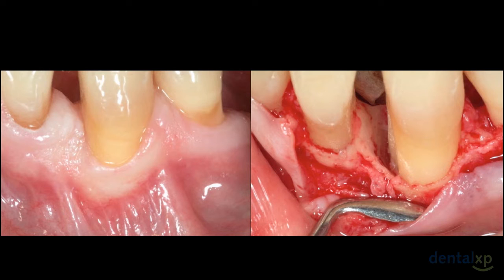Notice too that the periosteum is still present on the buccal. I plan, as I said, to do a connective tissue graft, and we'll use the periosteum to suture the graft in place.